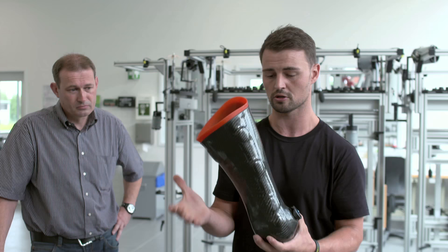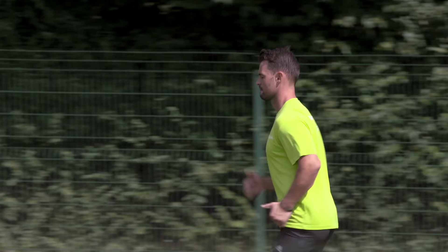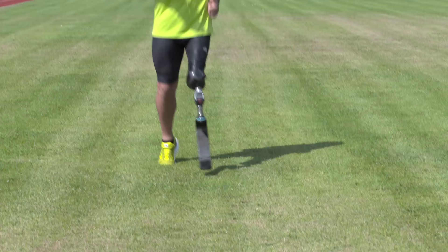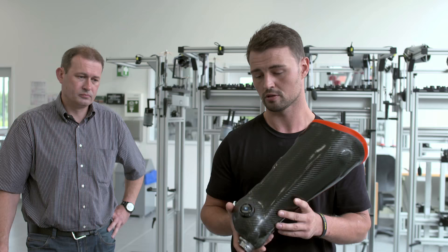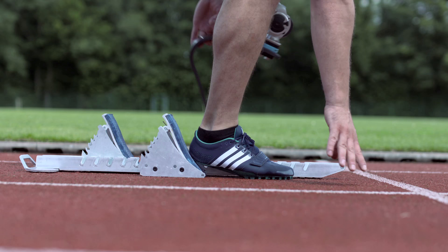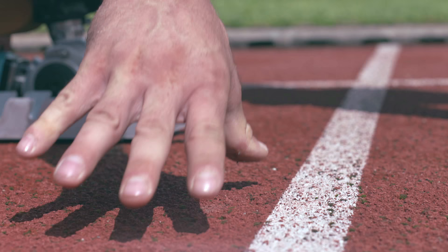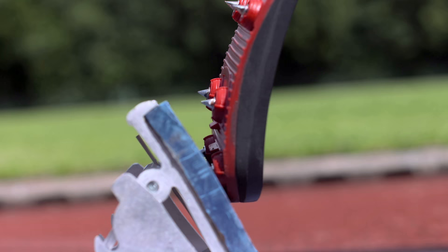When the socket is not fitting, my mind is not free to run. When the socket will twist, I can't bring the energy or the force on the ground, I can't accelerate, and I will not be happy to run because I have to trust every step that I'm doing. The feeling of trust is the first and most important thing I need when I go into the block.